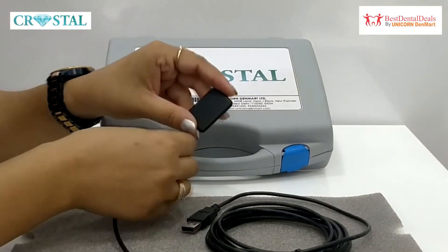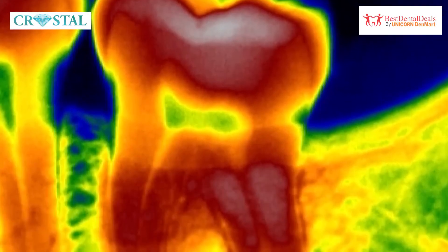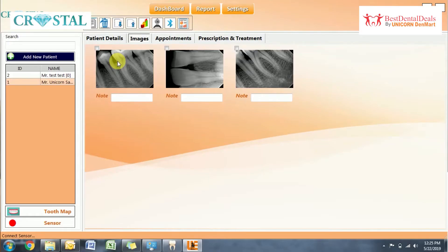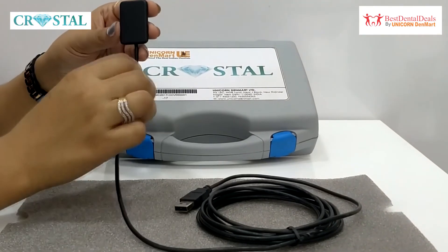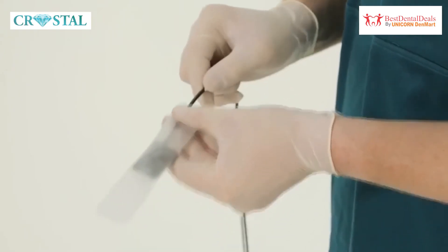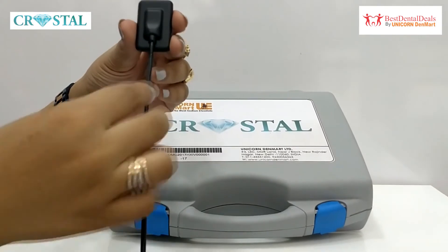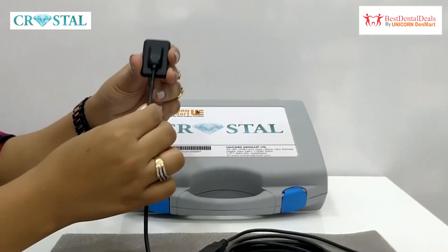Based on the latest complementary metal oxide semiconductor (CMOS) technology, the sensor provides high-quality imaging while preserving the life of the sensor. The sensor is made of IP66-certified plastic, preventing any damage from dust and water.